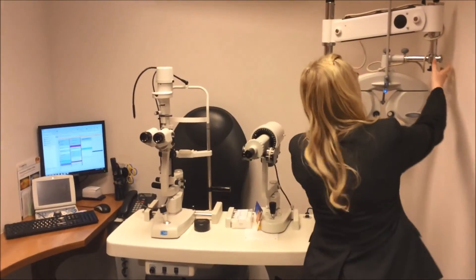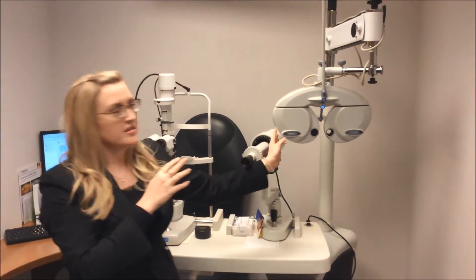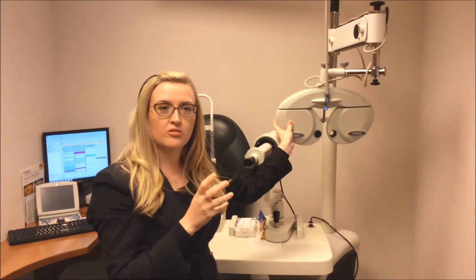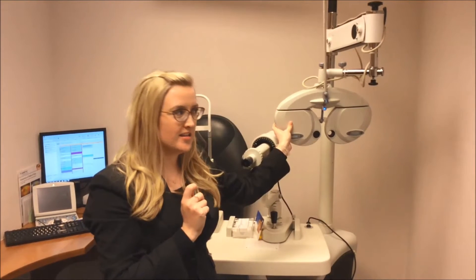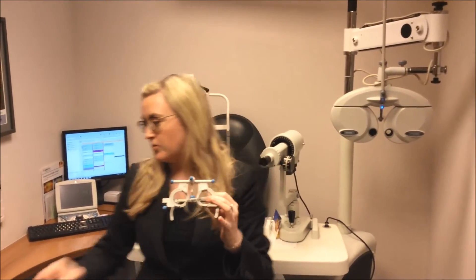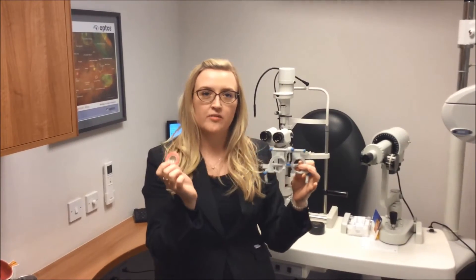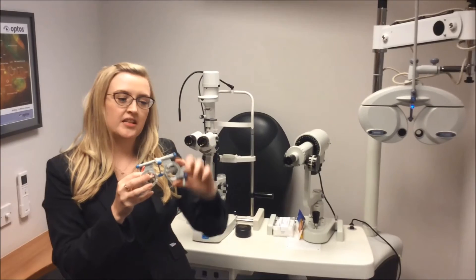And then this here is what we call the phoropter head. This is what we use to determine if somebody's long or short sighted and whether or not they're going to need assistance with glasses. A lot of people will be more familiar with the old style trial frame, which is what we placed different lenses in and out to determine if you needed glasses. So the phoropter head here has replaced the trial frame.